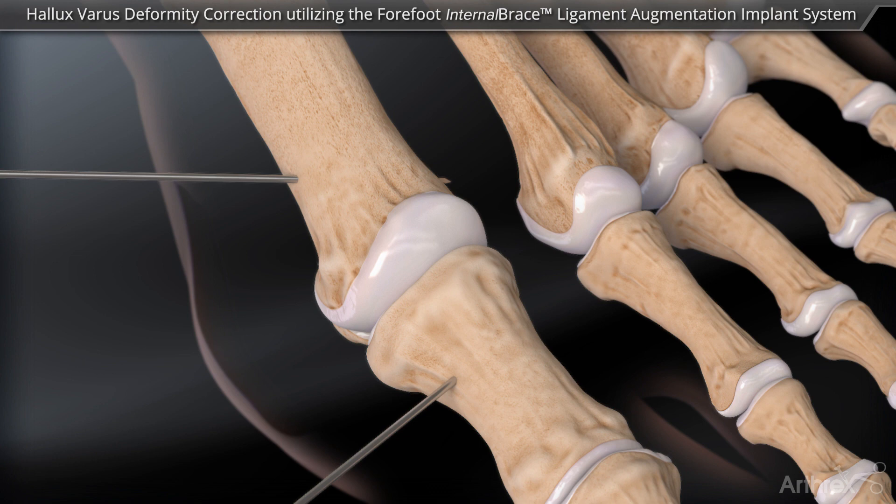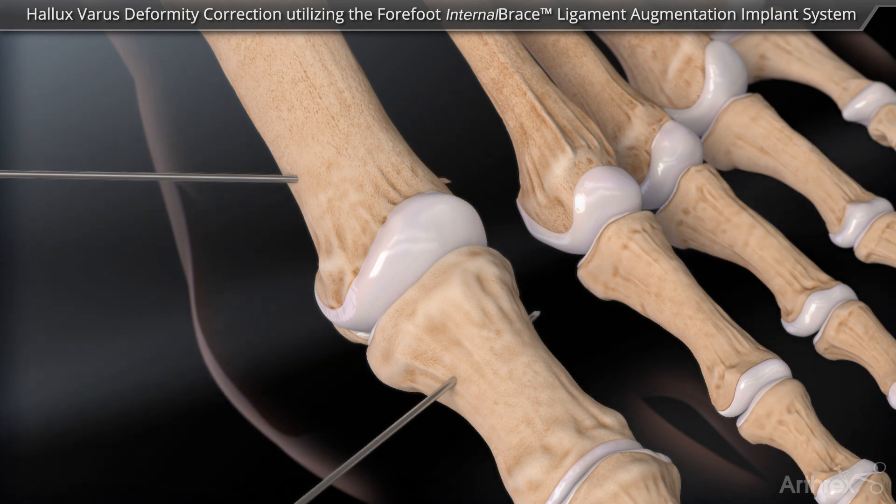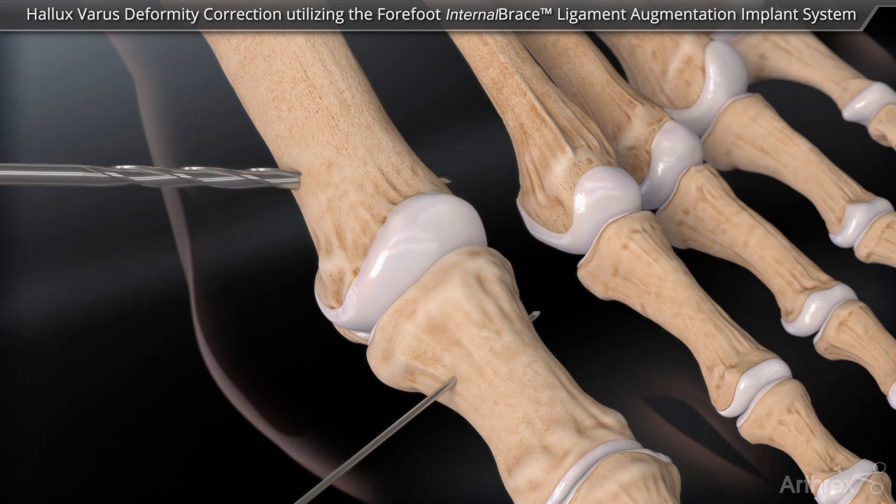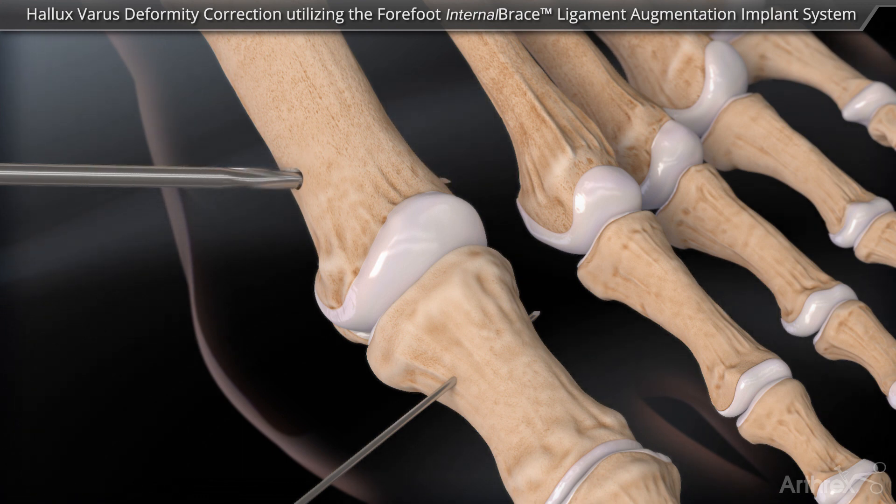A second guide wire is placed into the proximal phalanx, exiting just distal to the articular cartilage. The guide wires are then overdrilled with a 2.5 mm cannulated drill bit.